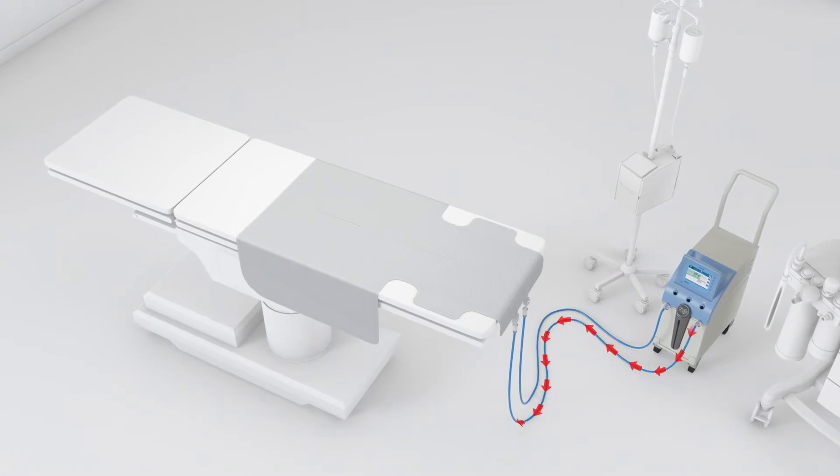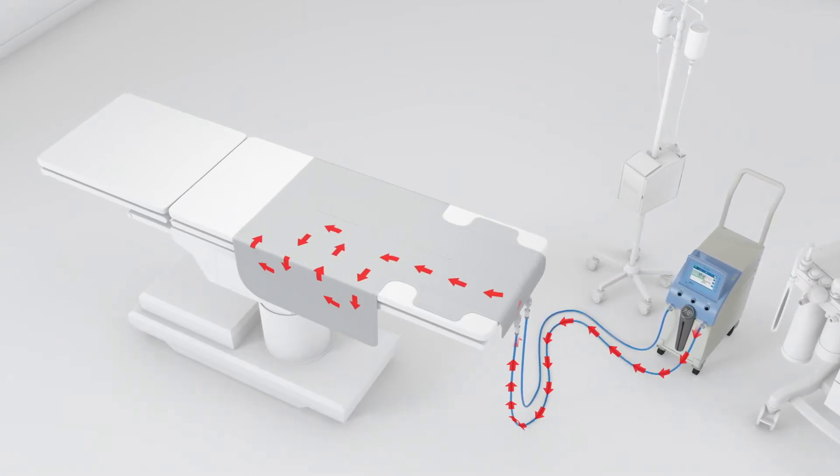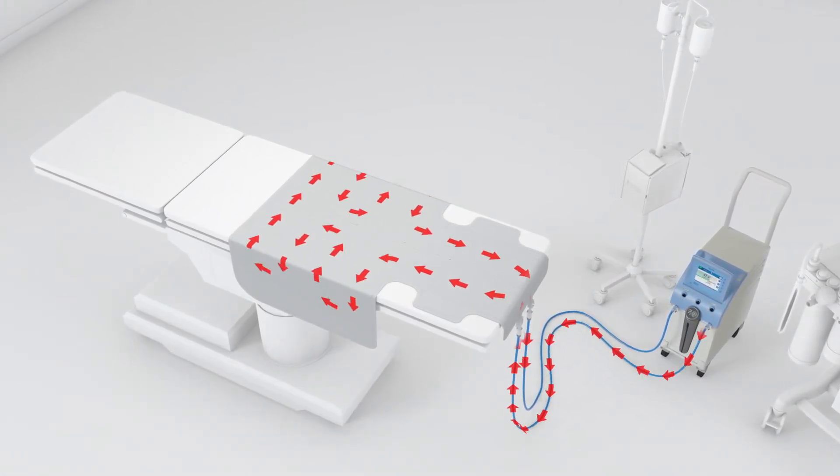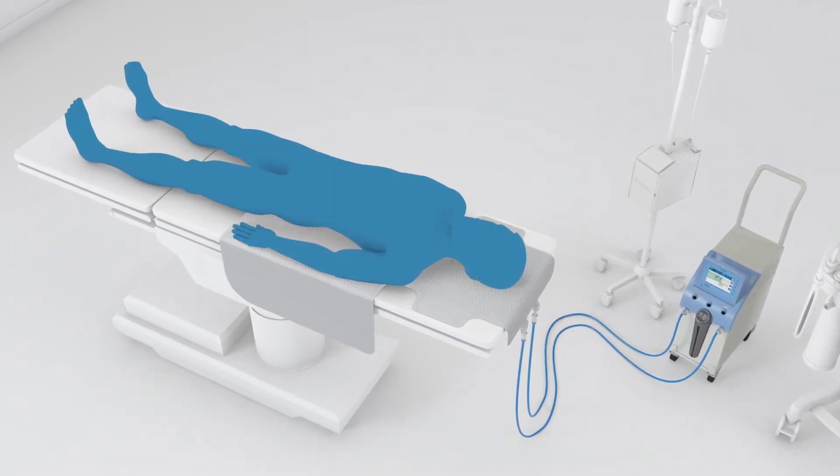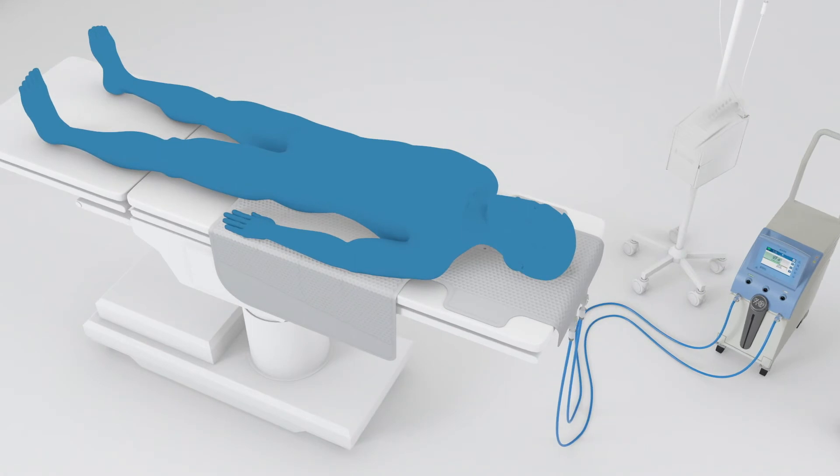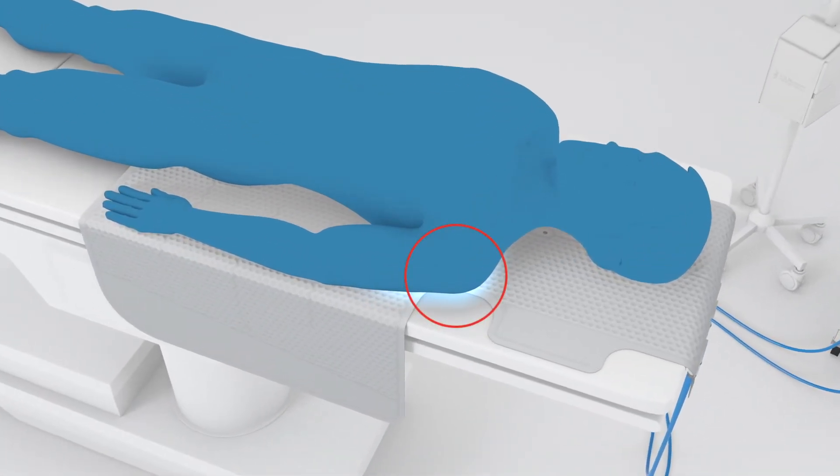When preheating is complete, the thermal wrap fills with water automatically. When the wrap is filled, it will already be warm and the patient can be positioned on the wrap. Be sure to note the proper placement of the shoulders on the wrap.